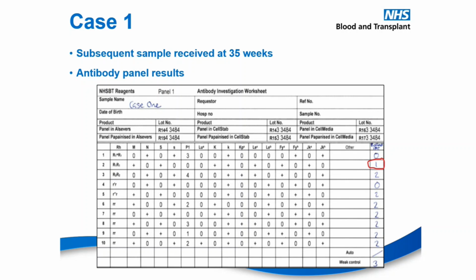So yeah, Sarah's saying that's the heterozygote. So it's obviously coming through fairly weakly, which is why it's negative. So we've got 2+ reactions with the homozygote, but we could pop up another heterozygote on another panel and potentially get it reacting as a 1+. So it's sort of looking at all of the results together and not just the one cell in isolation. But thank you for that comment. That's a really valid comment as to why sometimes these heterozygote expressions can be negative.